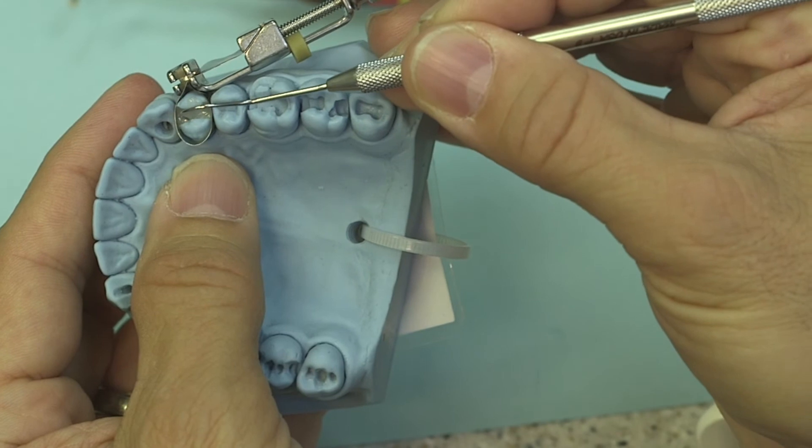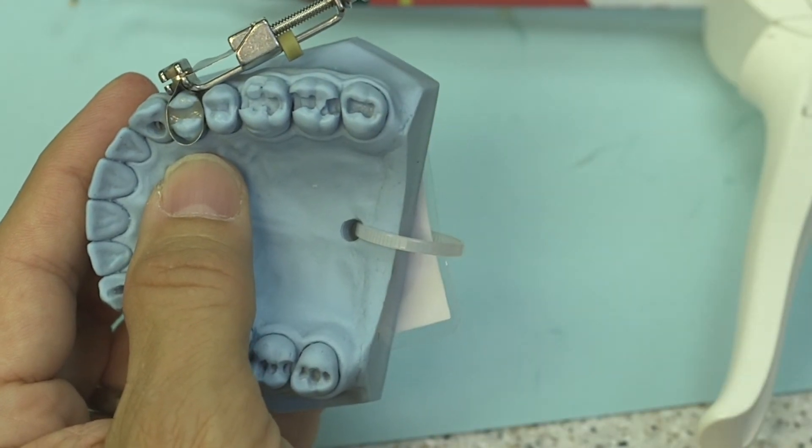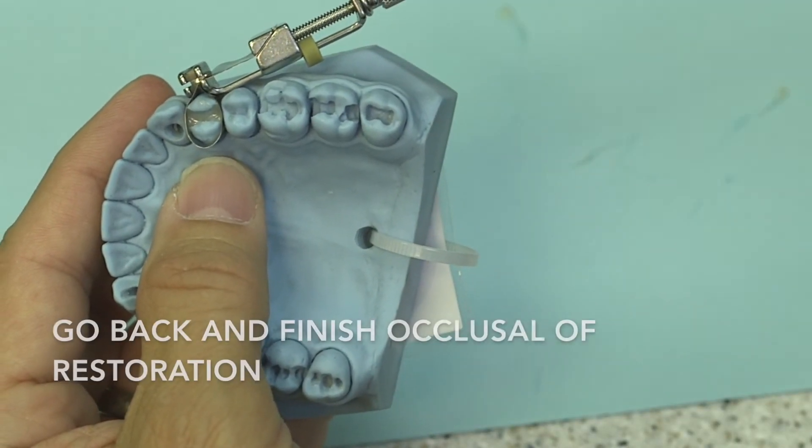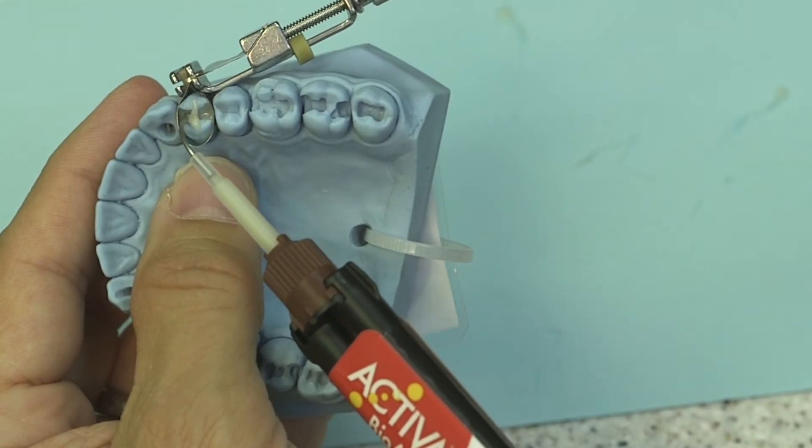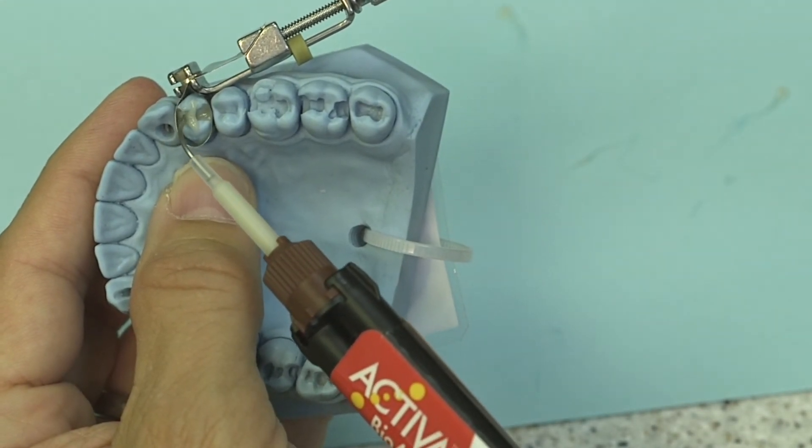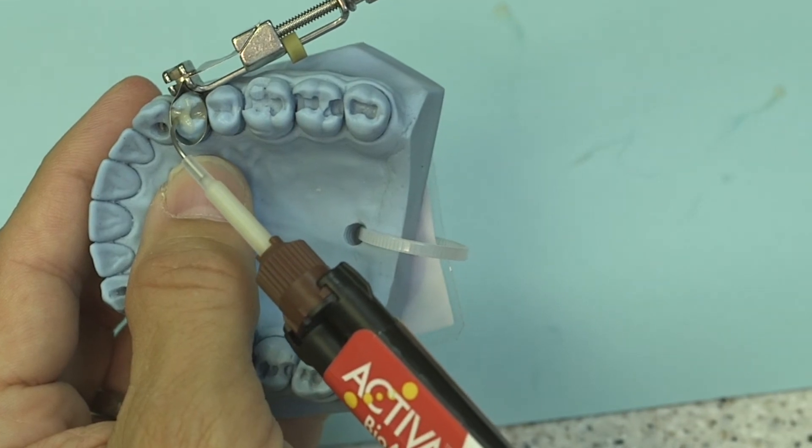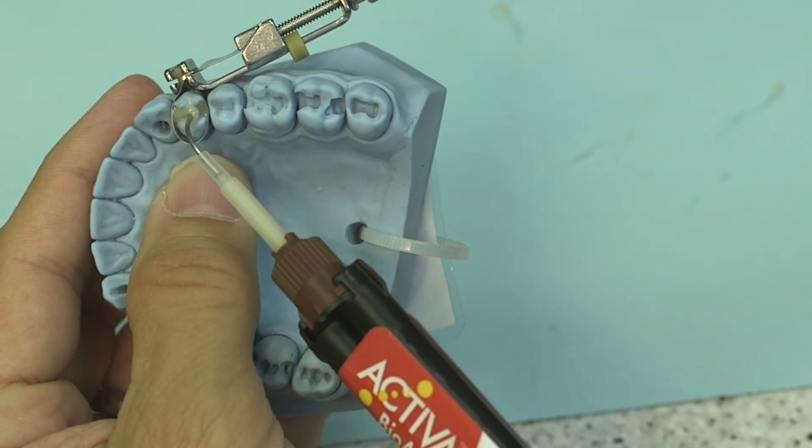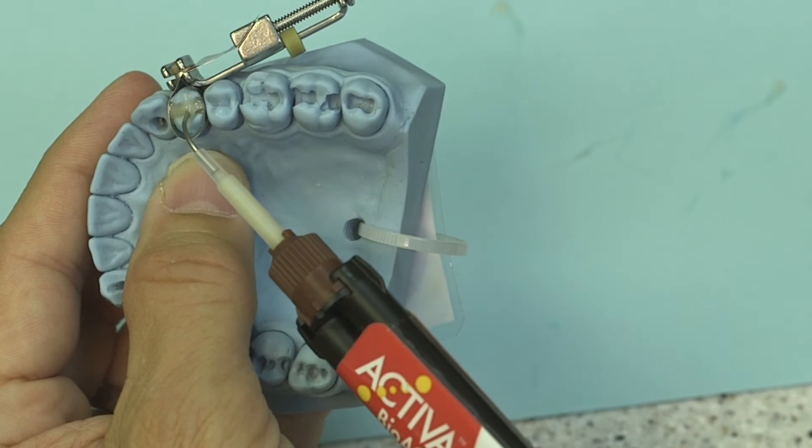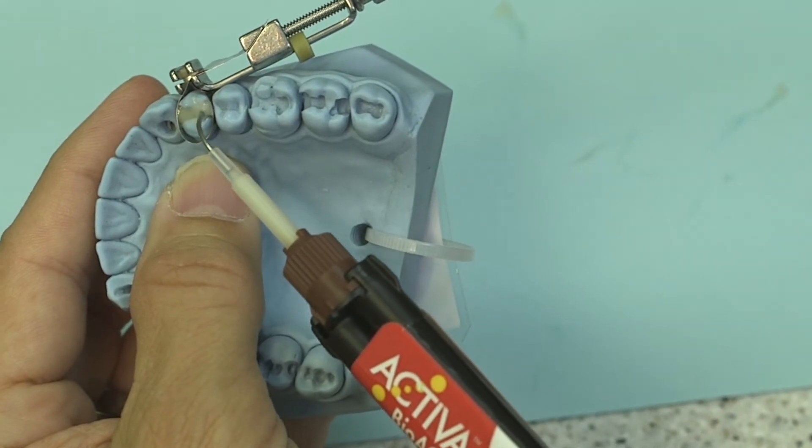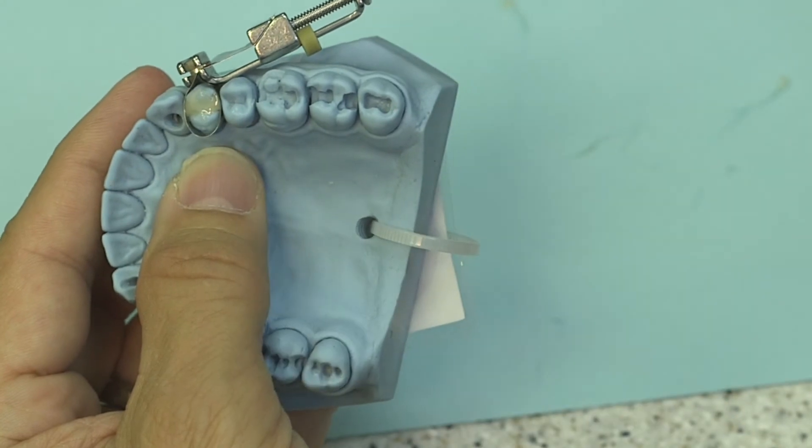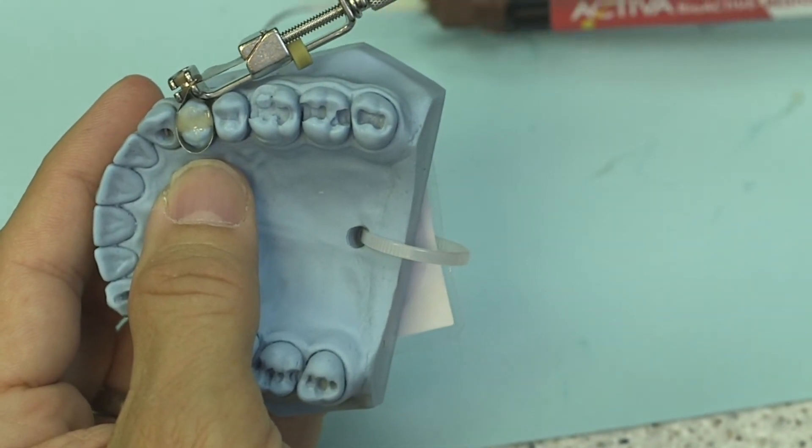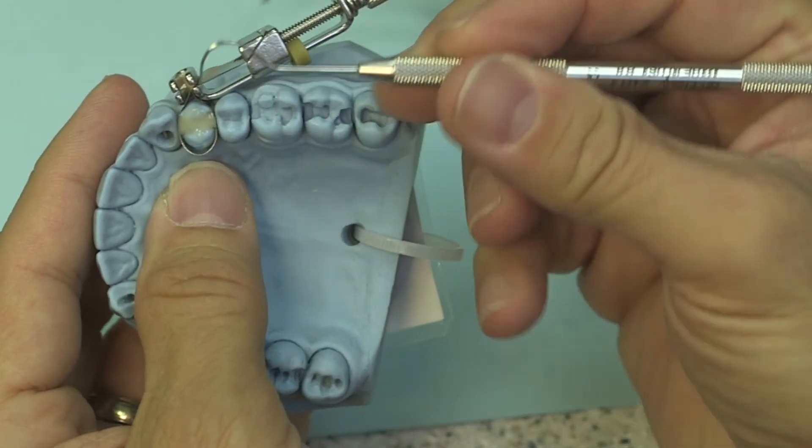Okay, so we filled the initial component of it. I'm going to go back in and just finish up the occlusal of the restoration, going to keep my cannula in the material, just fill it up. I overfill slightly so that this way I can go back in with my trimming burs after I've completed the preparation and give myself some really nice anatomy.